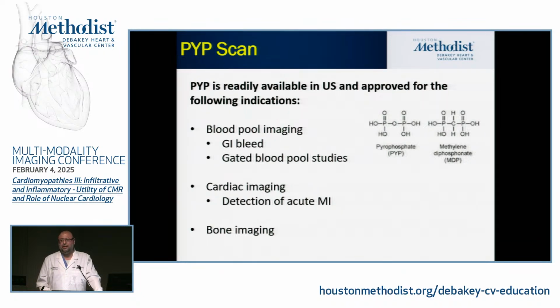It used to be, there were some studies done here to look at prior myocardial infarction. So Dr. Mamarian used to do some of these studies many years ago, where patients would come in with an MI and they want to know if it's a recent MI or old MI, they will do a PYP scan. If it lights up, it will help in the diagnosis.